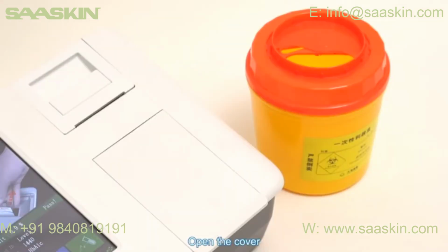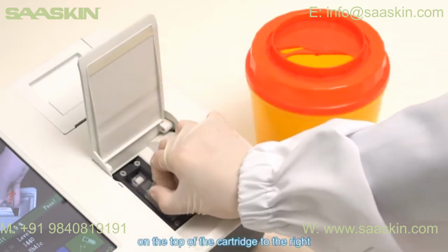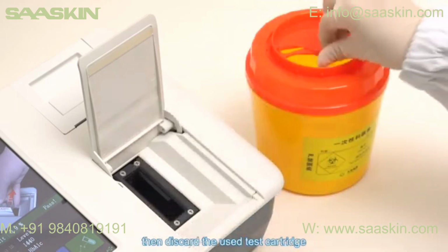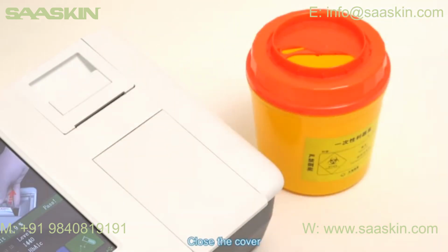Open the cover. Remove the used test cartridge by gently pushing the tab on the top of the cartridge to the right. Then discard the used test cartridge. Close the cover.